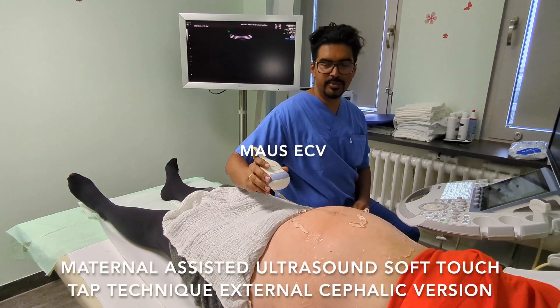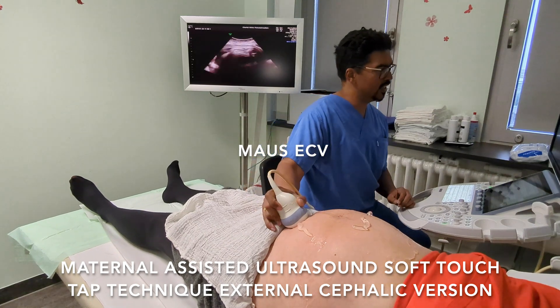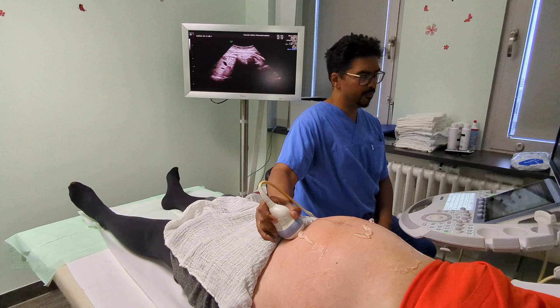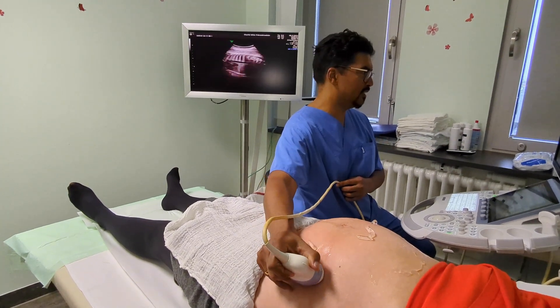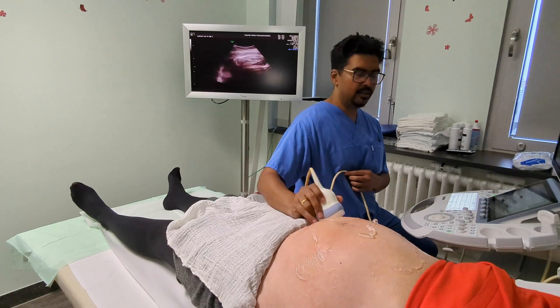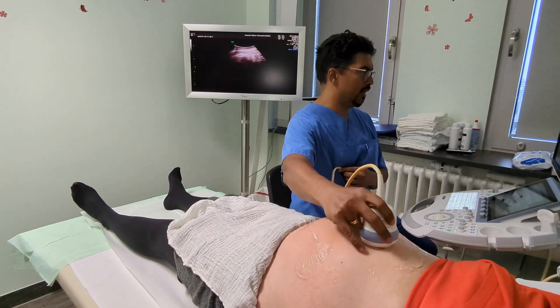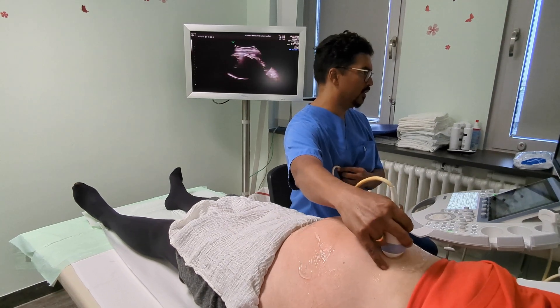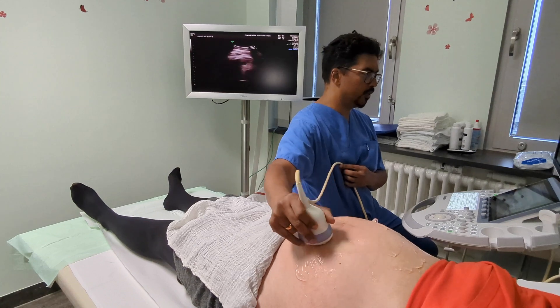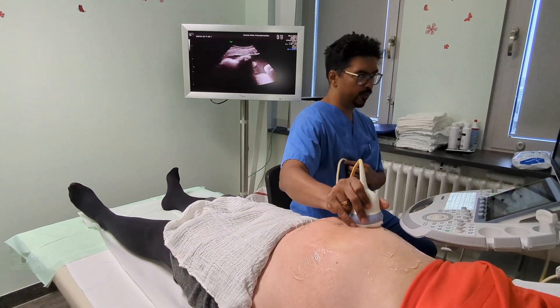We have a very nice patient today. As we can see, baby is lying in a breech position. The back is on the left side, the bottom is down here, the legs are flexed, the placenta is on the right side, and the head is up here. There's no evidence of a nuchal cord around the neck or the body, and there are adequate amounts of fluid around.